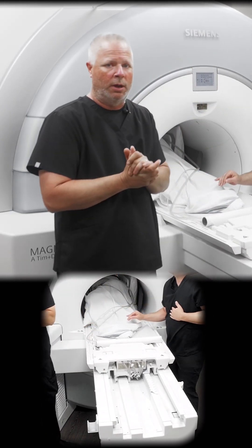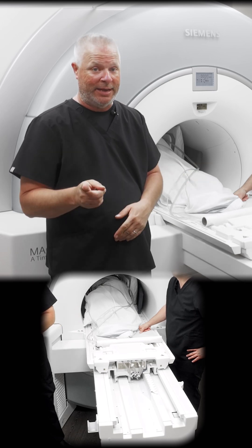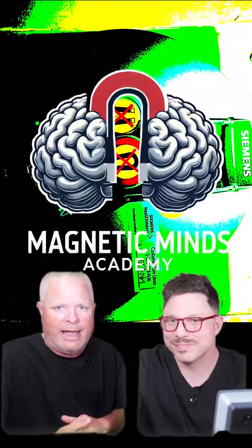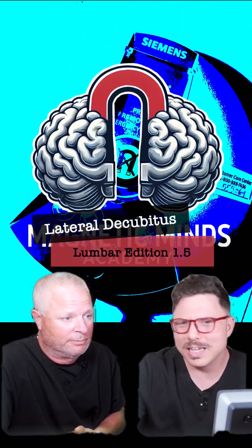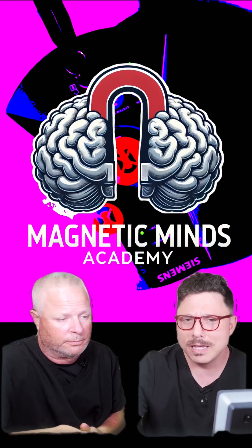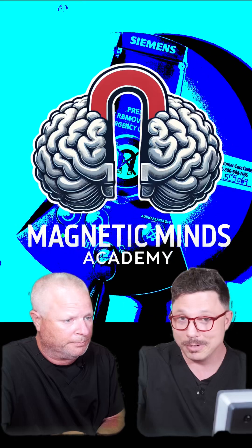We don't want any skin-to-skin contact — we don't want peripheral stimulation. Guys, this is just another way to show you how to scan a lumbar spine. We are back — we are scanning our patient on their side, right lateral decubitus. Not every patient can lay flat on their back supine. If you can't get them supine or prone, you can lay them on their side. In this technique, we put an 18-channel coil directly behind the patient's back. Yeah — and squeeze the ball.